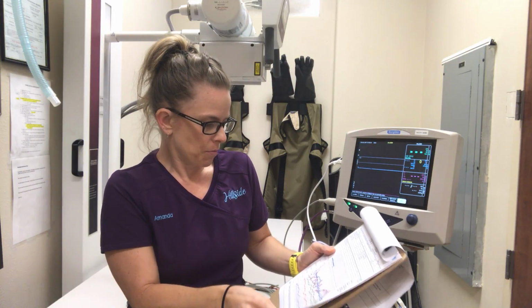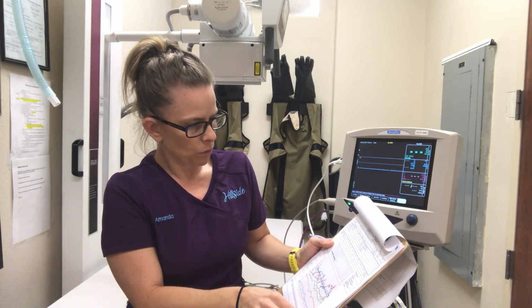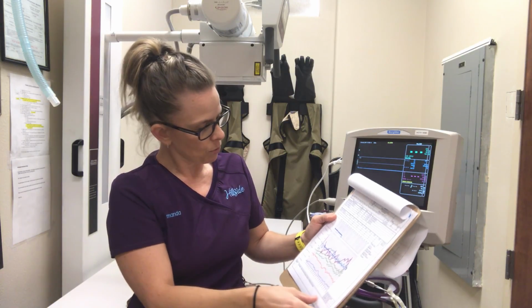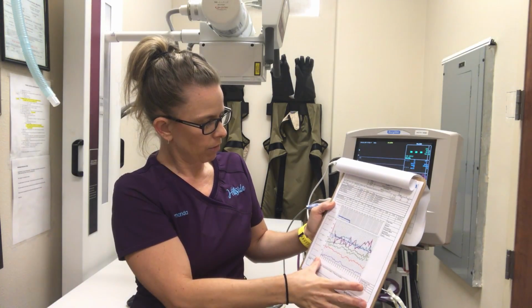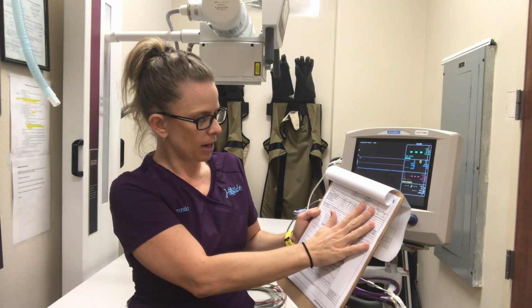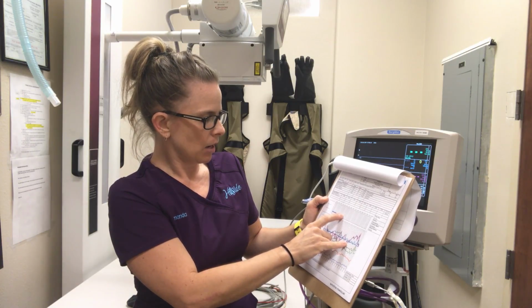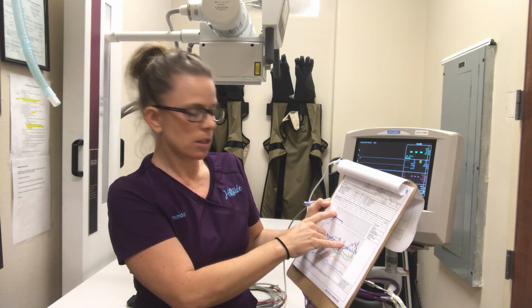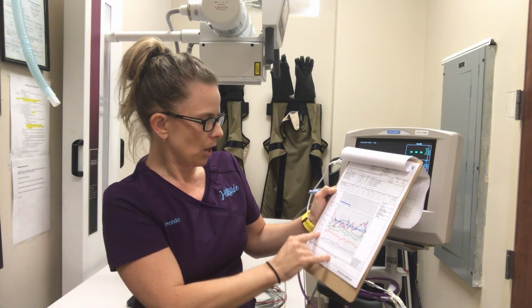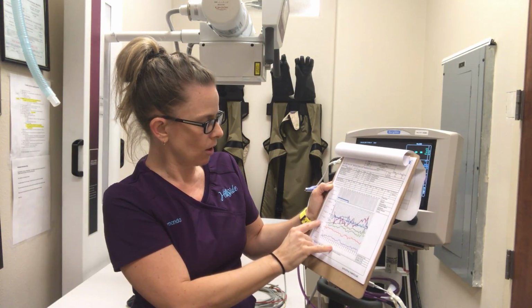Let's see, and then what we'll do is all of this information that is being recorded on the SurgiVet is recorded into one full summation of everything, and it just gives all of the patient information. It records by minute the anesthetic agent, the O2, and then down here I have graphs of all of them individually, but it breaks it all down.